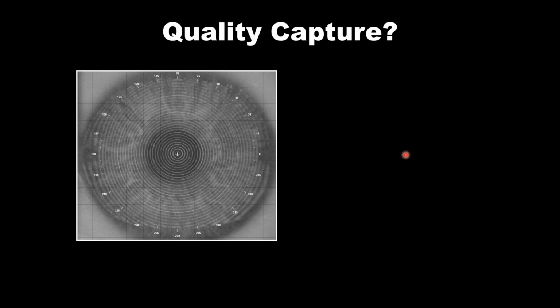Now, here is an ideal topography photokeratoscope image, an ideal topography capture. Now, what makes it really good? One of those things is we've got lids and lashes out of the way. We've got rings reflecting to the far periphery. The central rings especially look good. That's important because the topographer uses what's called an arc step algorithm to build the eye shape, elevation, and power from the center to the periphery.